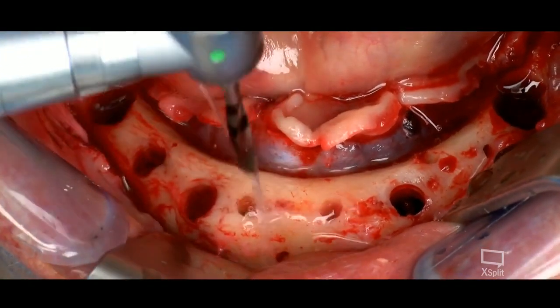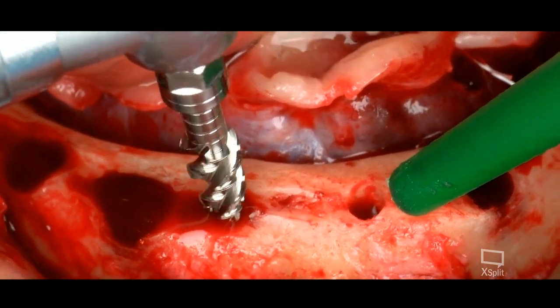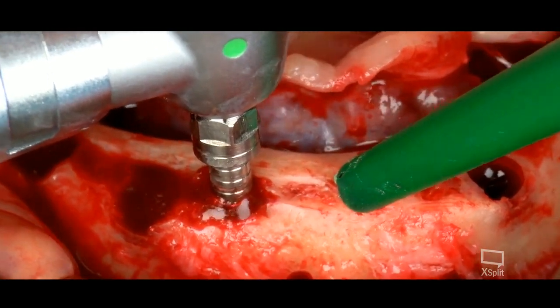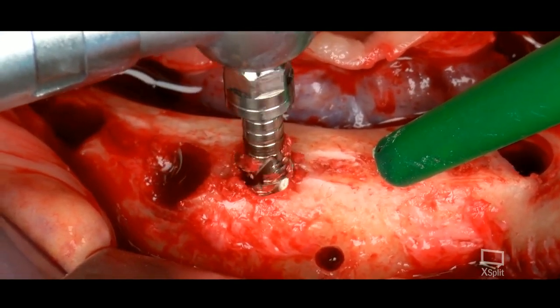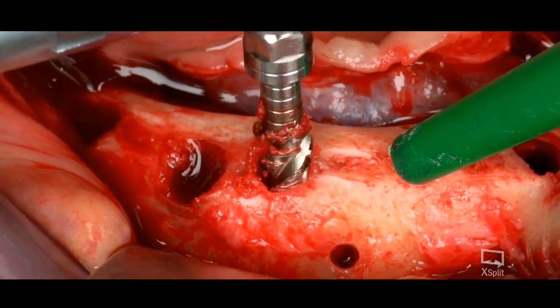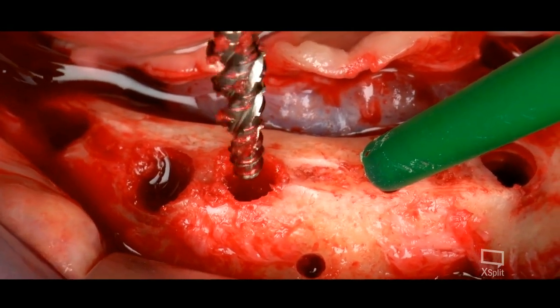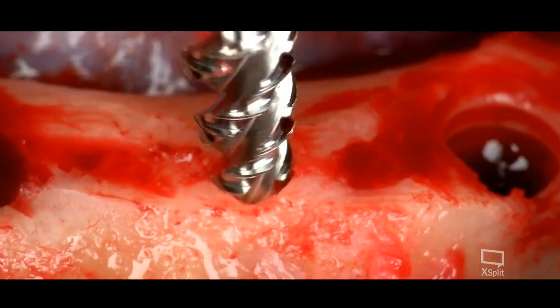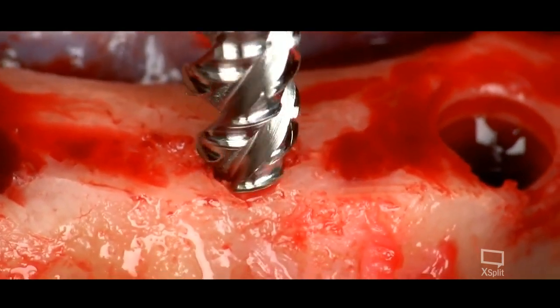Now you drill the second step, the hole for the implants. Free hand, of course, for the second step, but still with the first pilot hole guiding him to put the implants in a correct position.